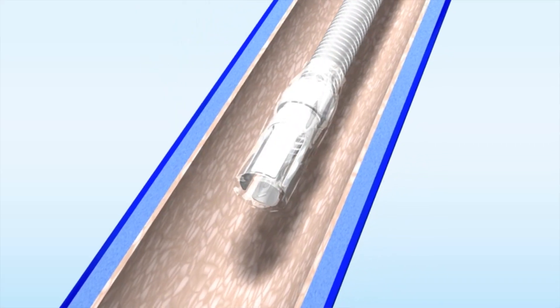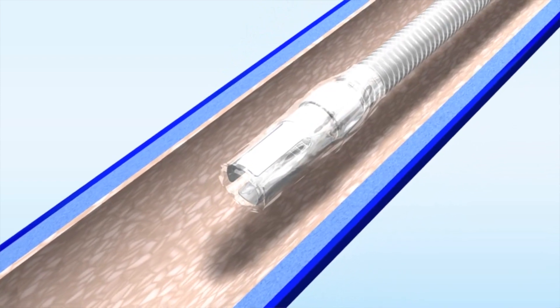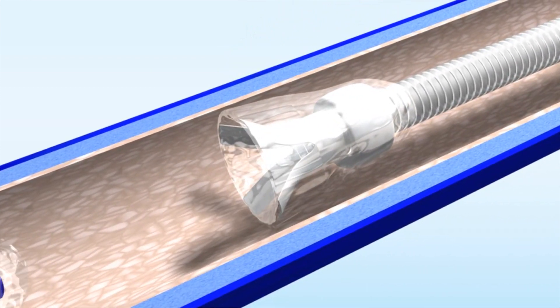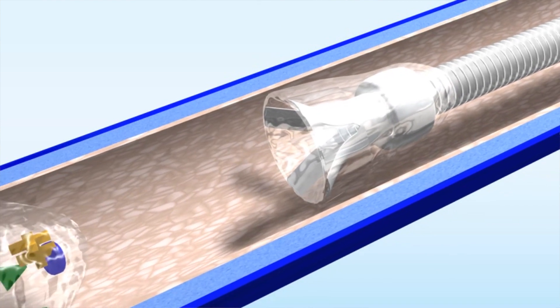This is the AngioVac aspiration catheter, and this is the device that we put in the neck that actually aspirates the clot from the veins. Although it's very large, the vein in the neck is about twice this size.